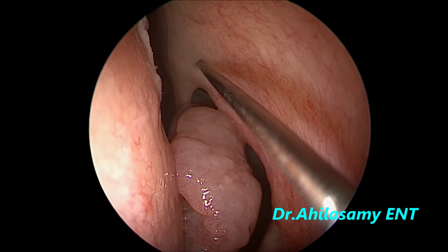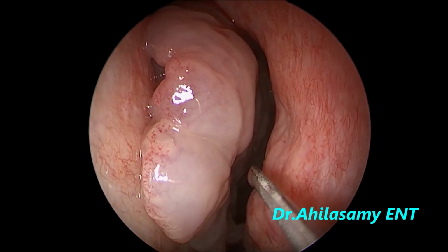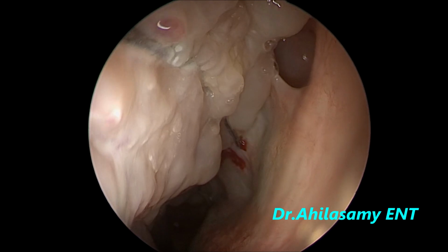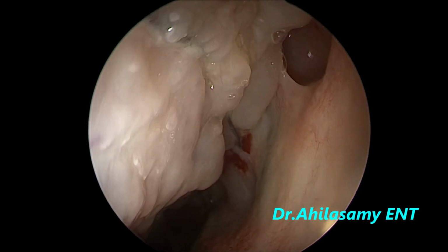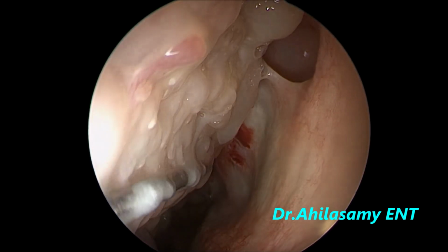Now I am giving the anterior ethmoidal block on the left side. Now I am giving this sphenopalatine block. The accessory ostia of the maxillary sinus is open.